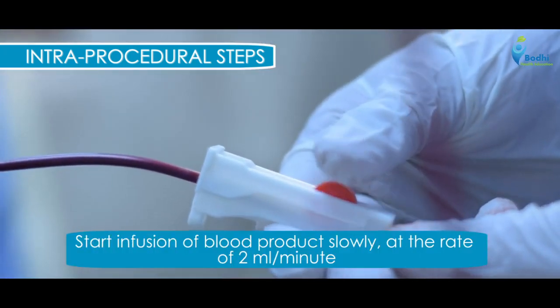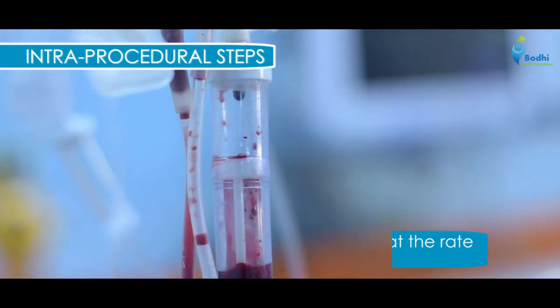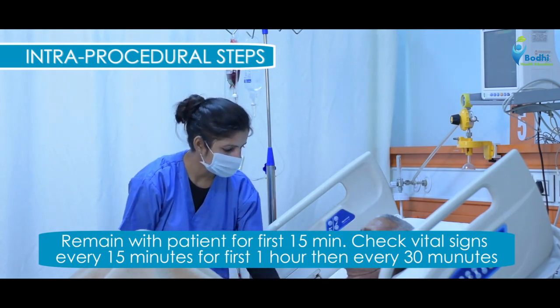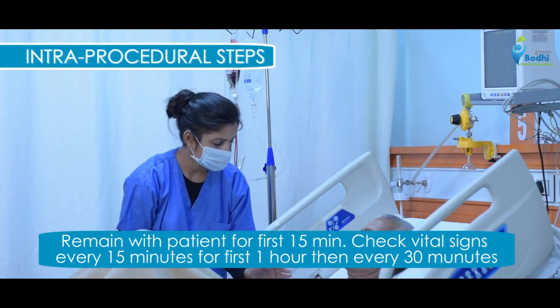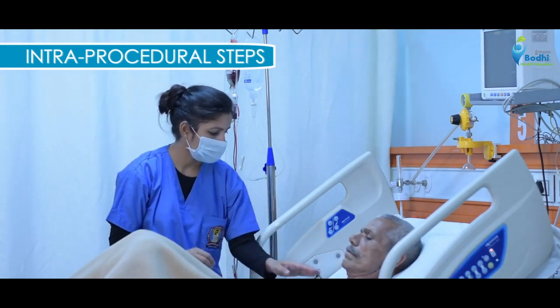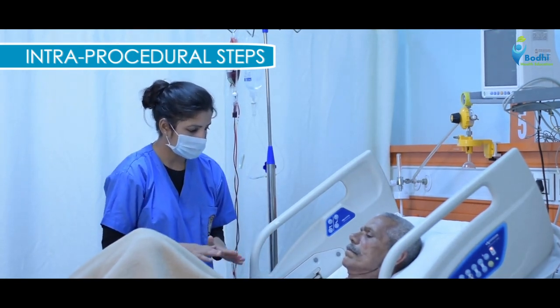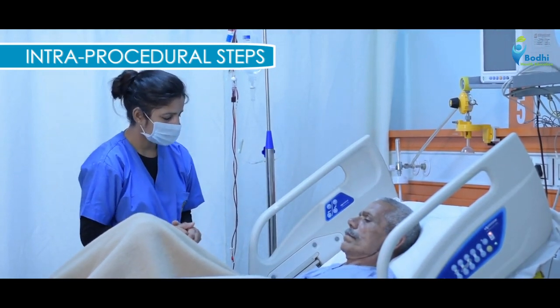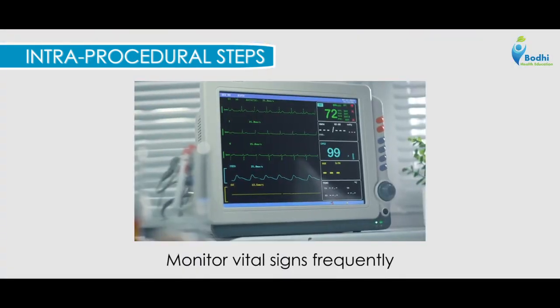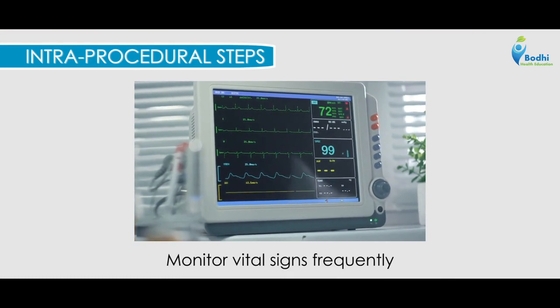Start infusion of blood product slowly at the rate of 2 ml per minute. Remain with patient for first 15 minutes. Check vital signs for 1 hour in every 15 minutes and then every 30 minutes. Transfusion reactions typically occur during this period. A slow volume can minimize the volume of RBCs transfused. Monitoring vital signs frequently helps in early identification of complications.